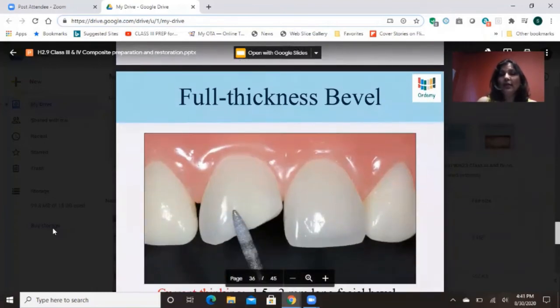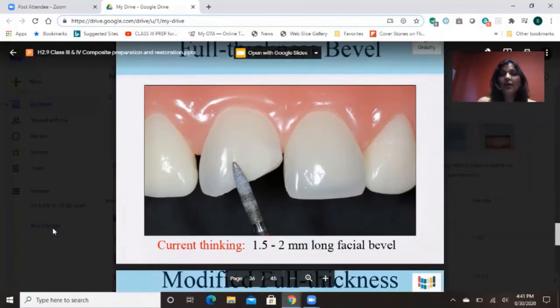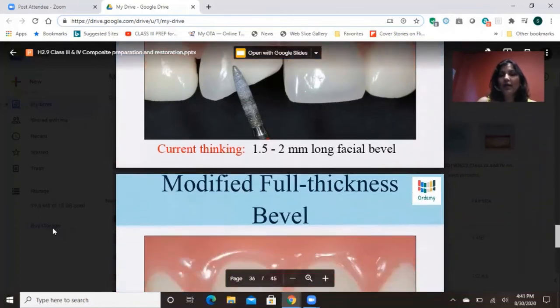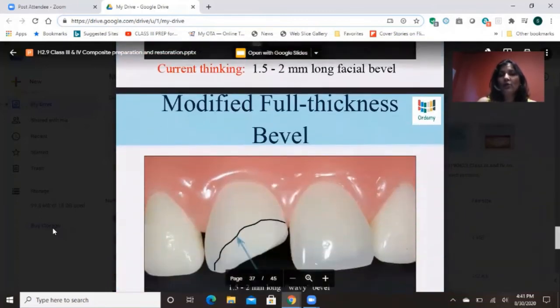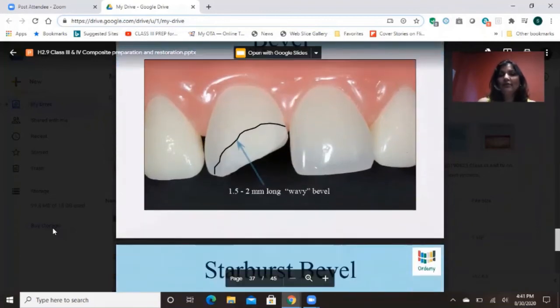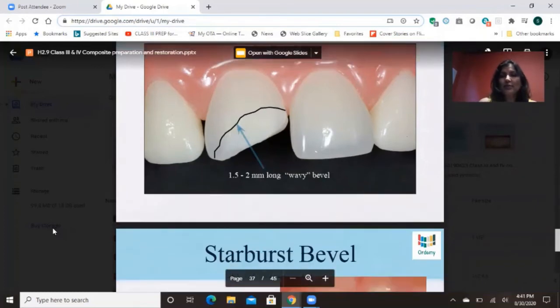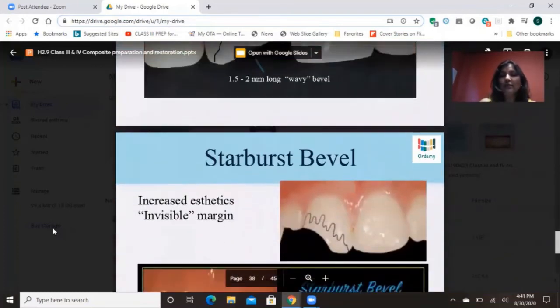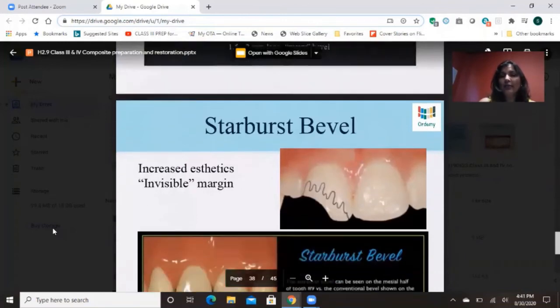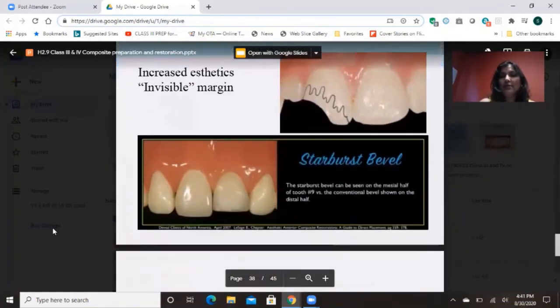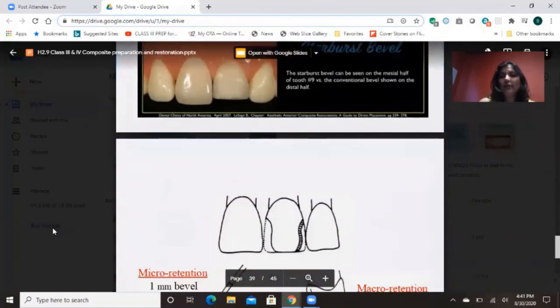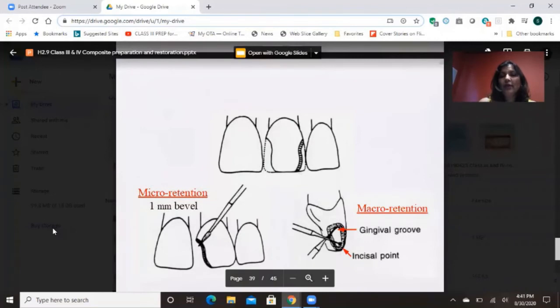For the bevel in Class 4: you remove the decay, and then the main thing is the full-thickness bevel — it's pretty thick, 1.5 to 2 millimeters long facial bevel. You can go with a modified full-thickness bevel, which is kind of a wavy bevel, or you can go with a starburst bevel, which makes it more aesthetic when you place the composite. Bevel is really, really important in Class 4 preparation.